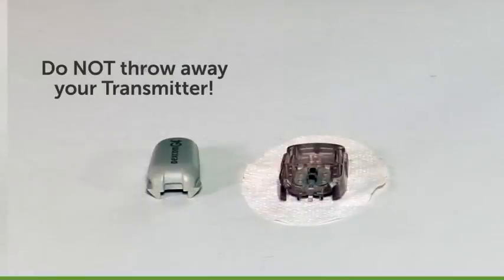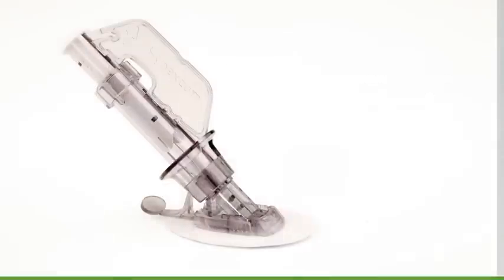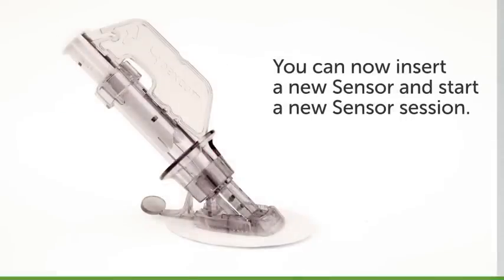Do not throw away your transmitter; however, you will throw away your sensor. You can now insert a new sensor and start a new sensor session.